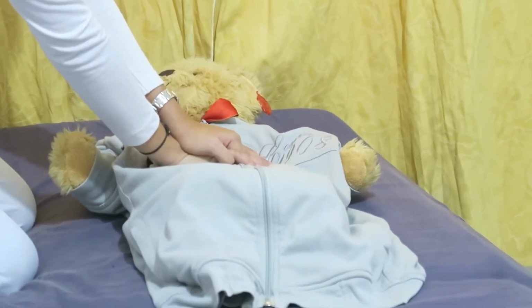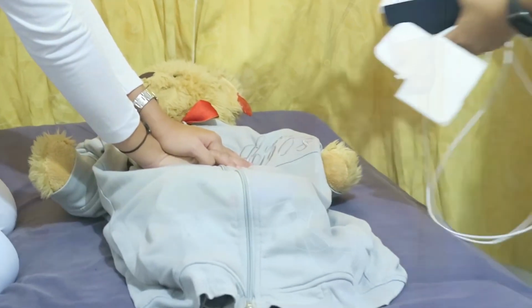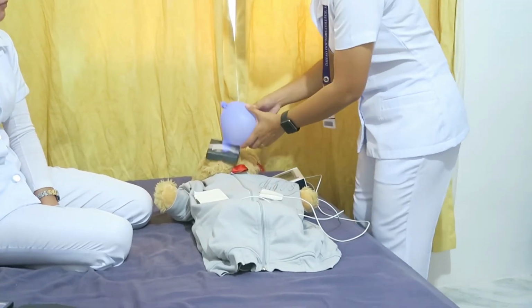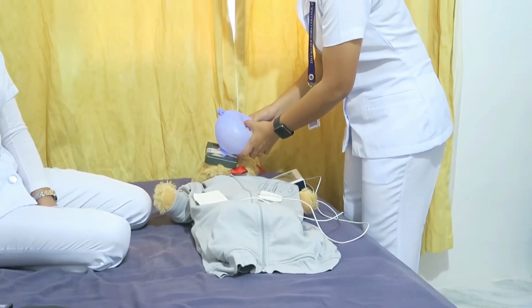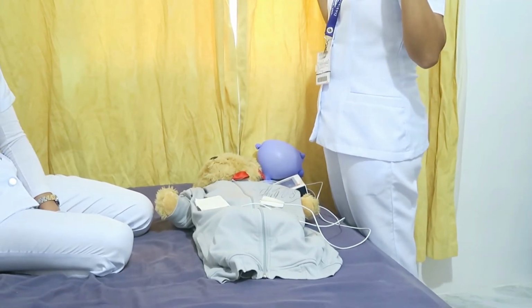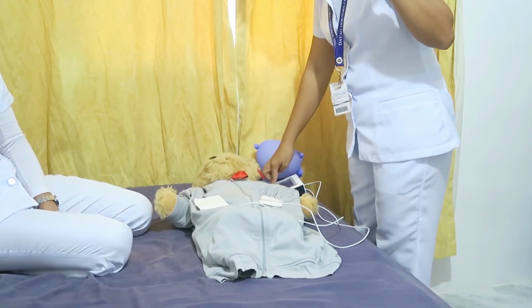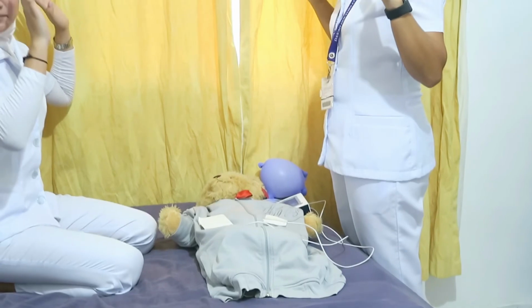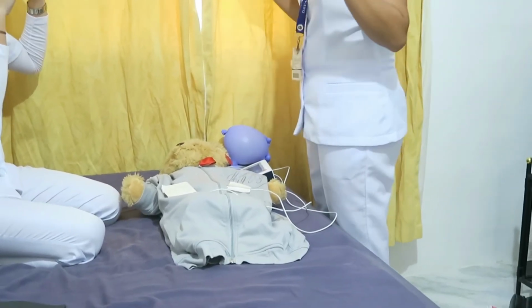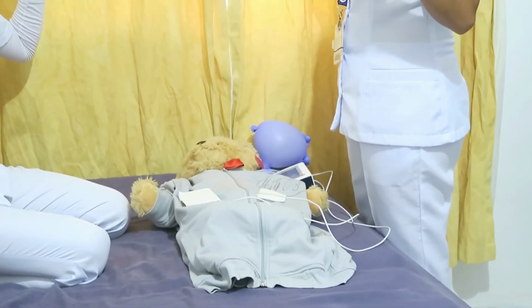Correctly attach the pads. Clear for analysis. Shock advised. Charging. Stand clear. Clear. Press flashing shock button. Shock 1 delivered. Safe to touch the patient. Begin CPR now.